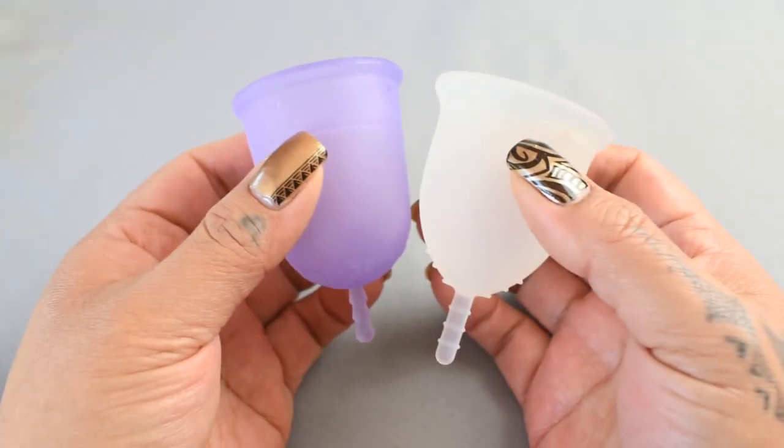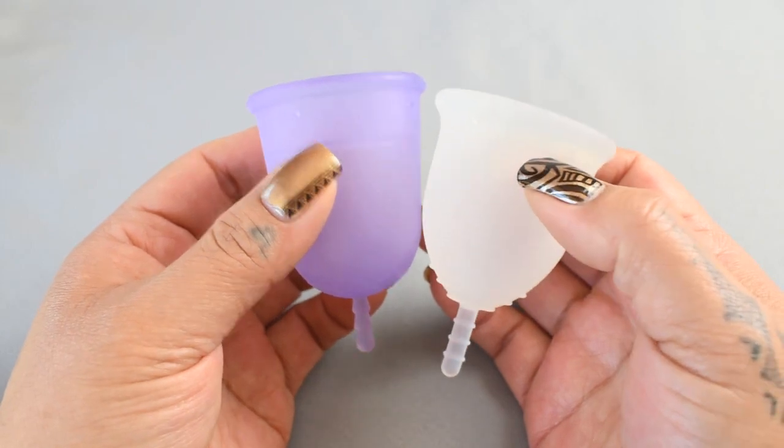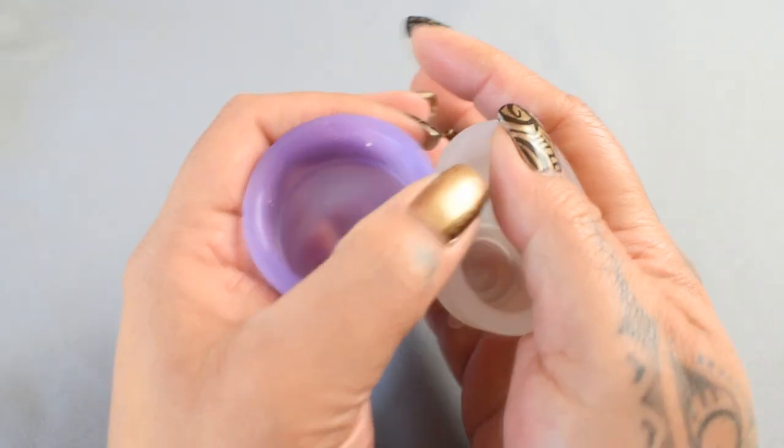Since these two bodies are different shapes, I'm going to move the Lena cup down just a bit so that the bodies line up better.